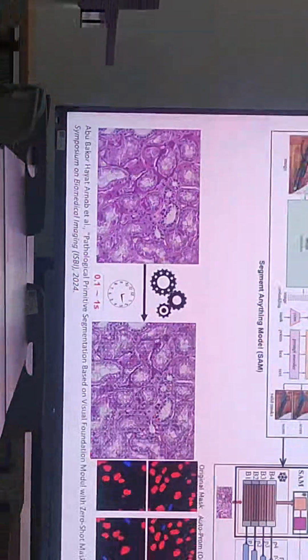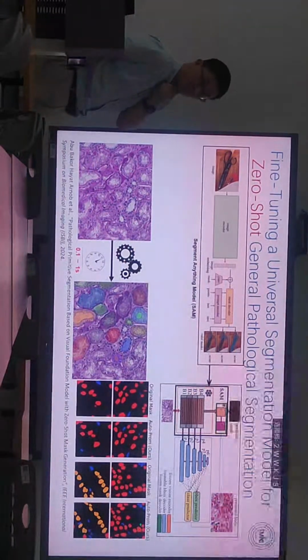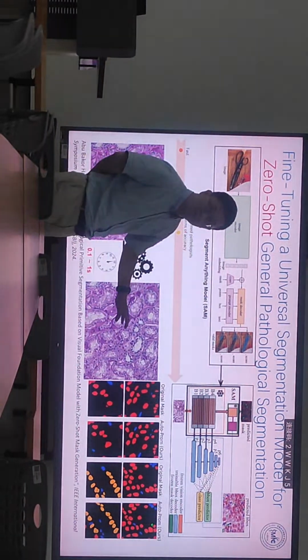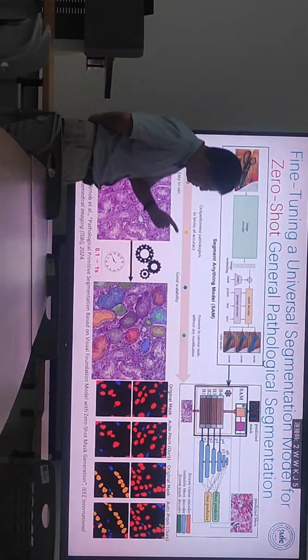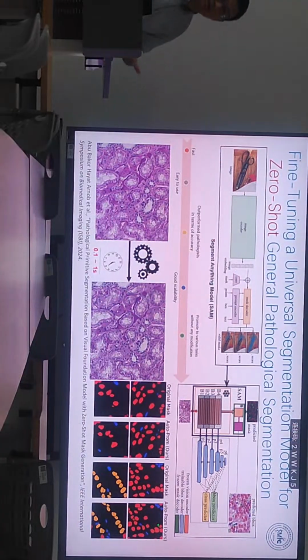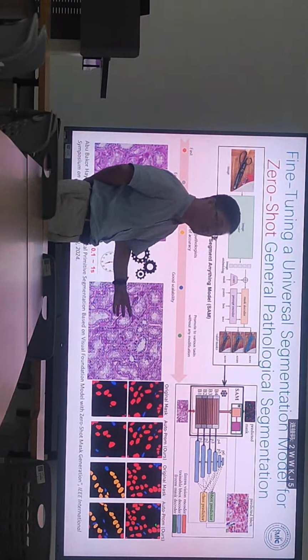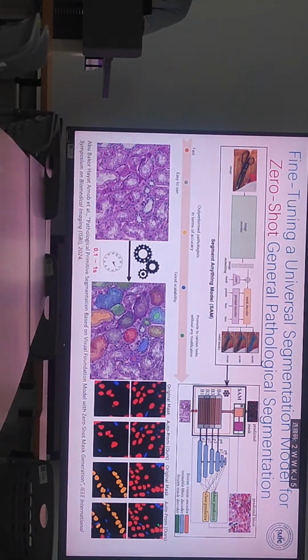So for instance, as Professor Manson said, we can use a zero-shot model, Segment Anything. We can automatically segment different parts from these tissue samples, for instance, the cells, the tissues and the lumen. Why is it important? Because all these cells, tissues and lumen are very important for making decisions for the diagnosis and prognosis of the disease.